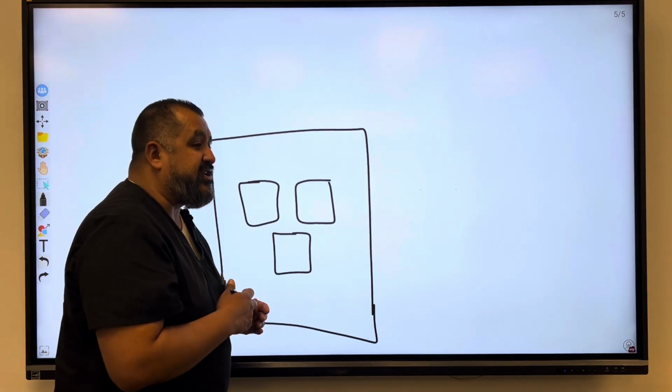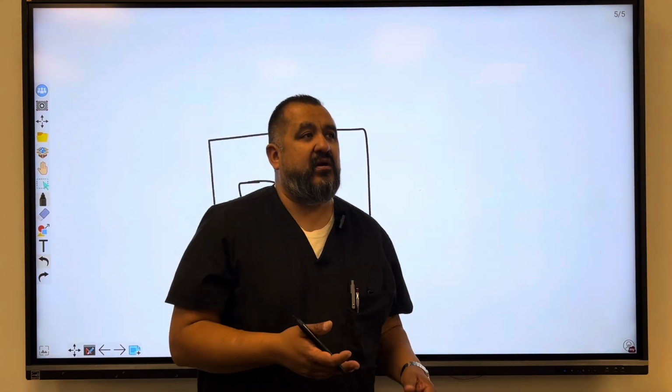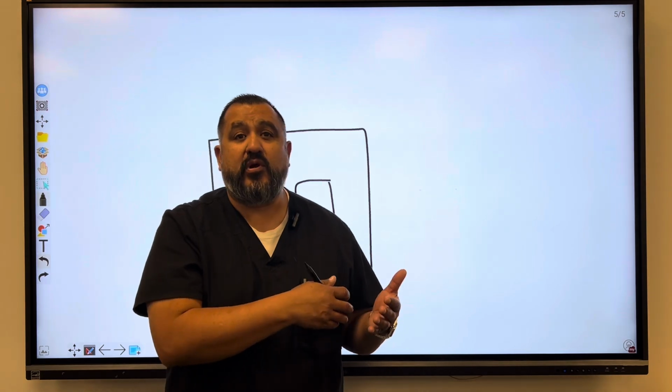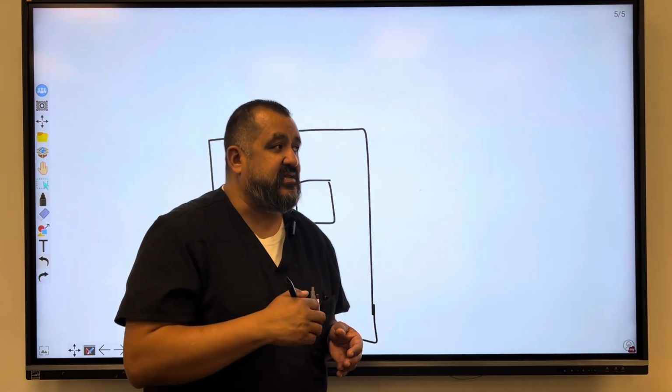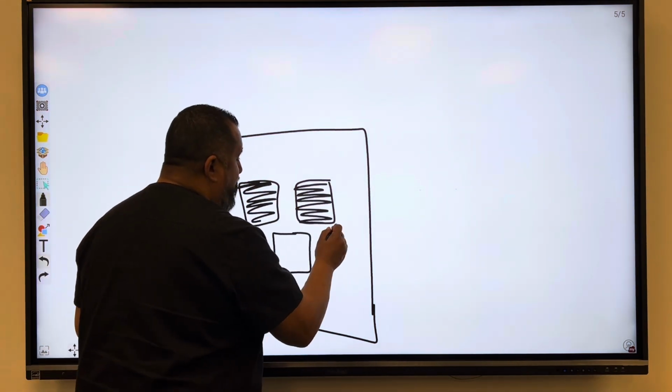So if you're doing a PA chest, let's say you had APR, the automatic or anatomic program radiography system, and you hit AEC. If you hit PA chest, it would automatically activate the upper outer chambers for you.